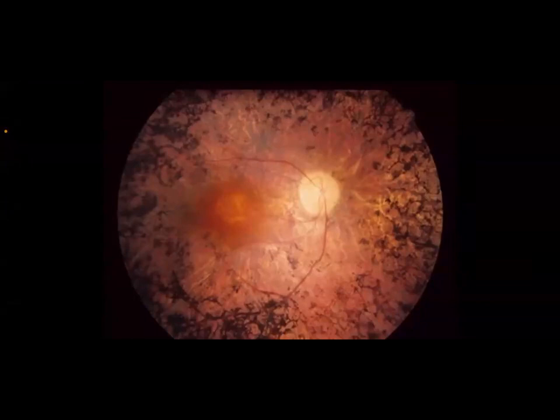Last thing I would like to add: when we start doing the ophthalmoscopic examination, we started with the light reflex. We followed the pink color of the retina. We landed on one of the retinal vessels. We used the V shape to guide us toward the optic disc. In the optic disc, we examined for any evidence of optic atrophy or papilledema. Then we went out of the optic disc and over the blood vessels to look for any arteriovenous nicking, dots or blots, hard or soft exudates.